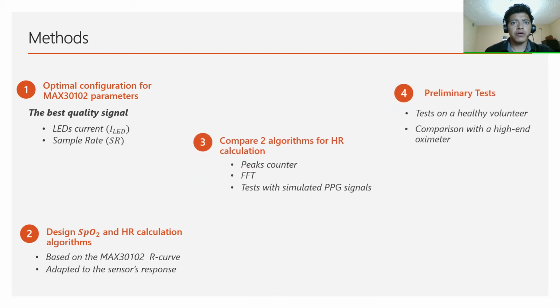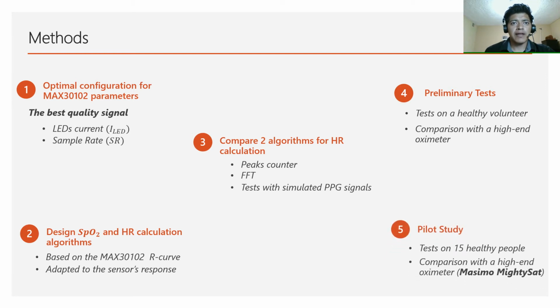At this point, we already had the first prototype, which was evaluated with a series of preliminary tests performed on a volunteer by comparing the prototype with a high-end commercial oximeter. Finally, we carried out a pilot study on a group of 15 healthy people to evaluate the performance of the prototype in a real environment.